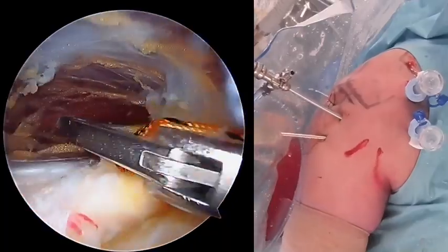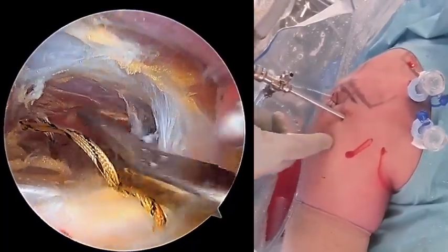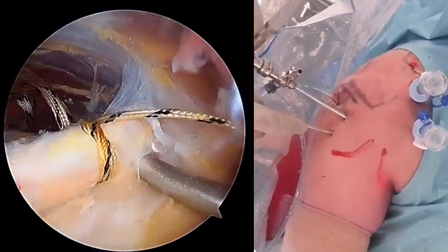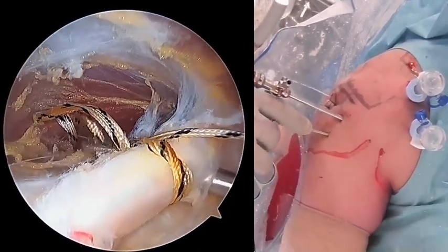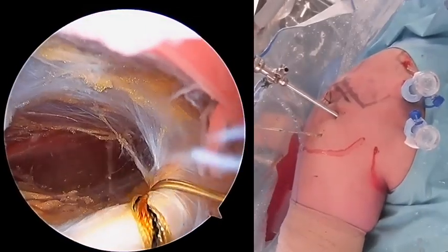A penetrator is brought in through that port after positioning the suture anterior to the biceps tendon so the penetrator can pick it up. Here the penetrator is passed through the biceps tendon, picking up the suture, so that the suture end is then brought through the biceps tendon, locking the construct.